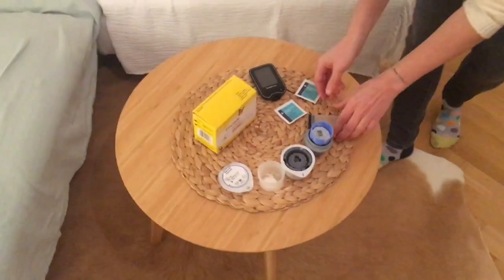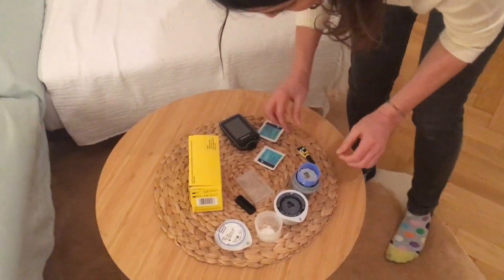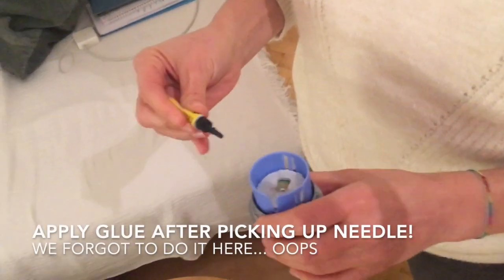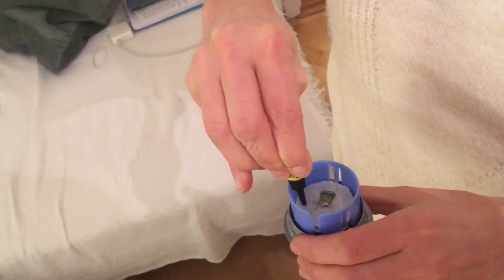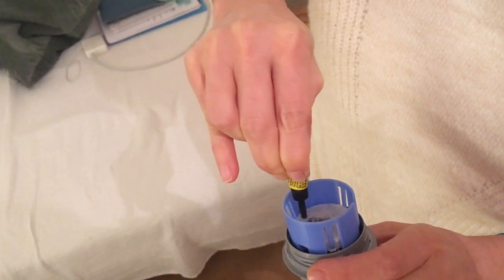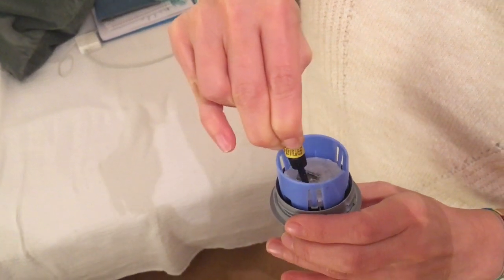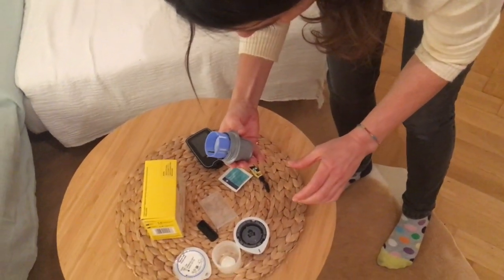Getting everything ready. Put a little bit of glue — a few dabs or a little circle. You don't want to put too much glue, otherwise it oozes out, and you don't want to put not enough glue because otherwise the sensor falls off. So this is a bit of a question of experimenting and finding the right amount. We've shaved the spot — you can either get a fancy pet sensor shaver.